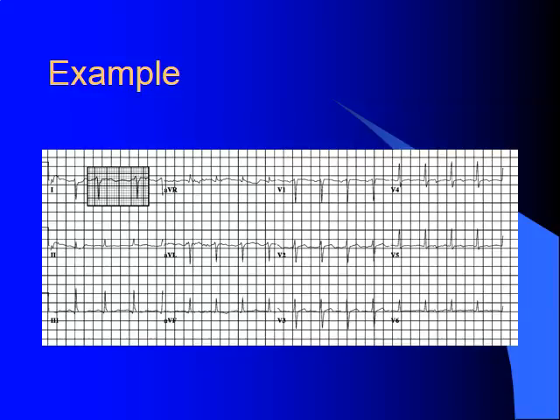So using AVR, which is our most isoelectric or equiphasic lead, we know that lead 3 is the perpendicular lead to AVR, and lead 3 is mostly positive, so our axis is right at plus 120 degrees. So we do have right axis deviation, which is one of the criteria. So this is an example of the rare posterior fascicular block in isolation.